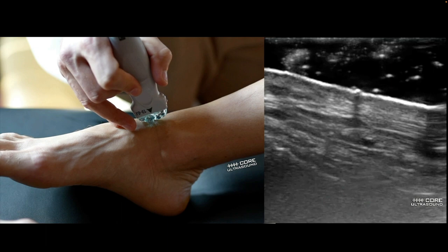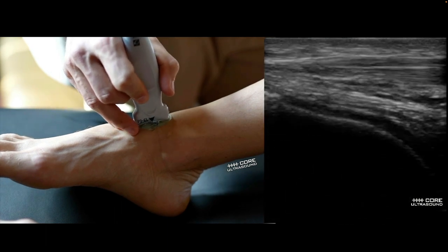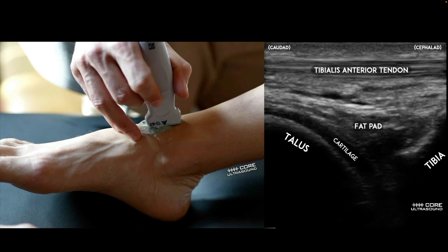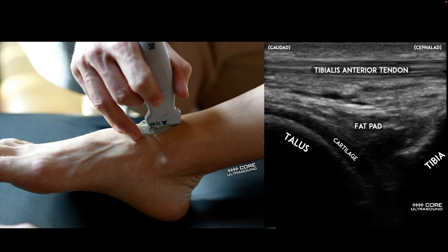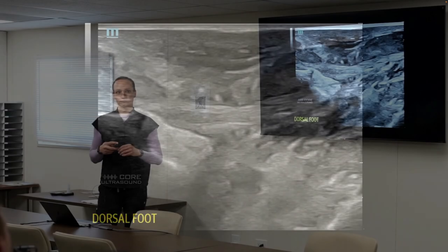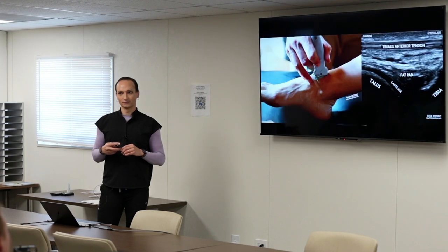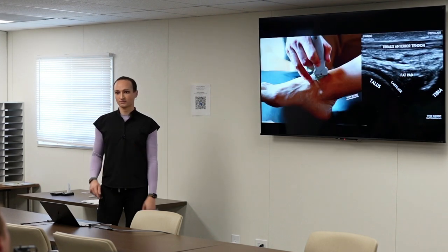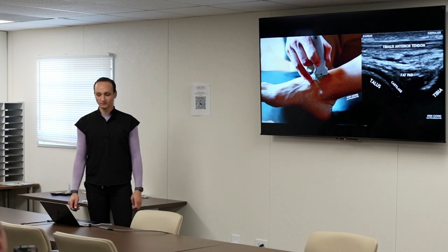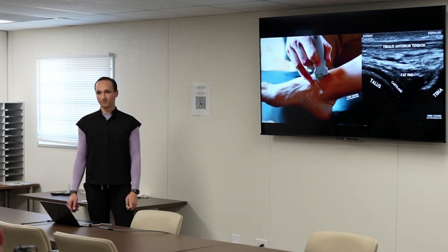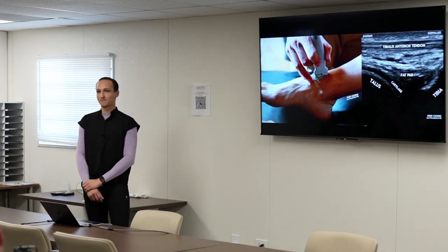Quick bonus section on ankles. Place the probe marker facing up in a sagittal orientation, looking at the tibiotalar region. There's a bit of hypoechoic material at the end of the talus — compressing it confirms non-compressibility, so that's cartilage. An important positioning tip: having the patient point their toe down plantarflexes the ankle and opens the joint space more. If doing a landmark-based approach, flex the great toe to track the tendon and get between structures, then point the toe to open the joint before entering.